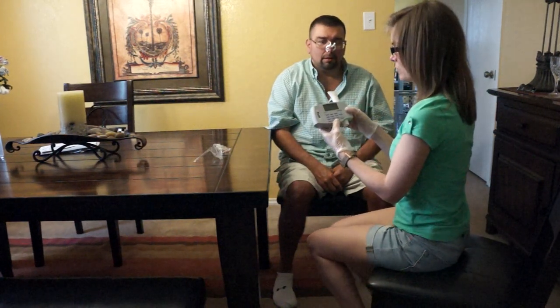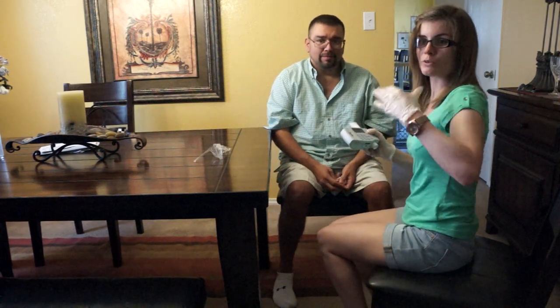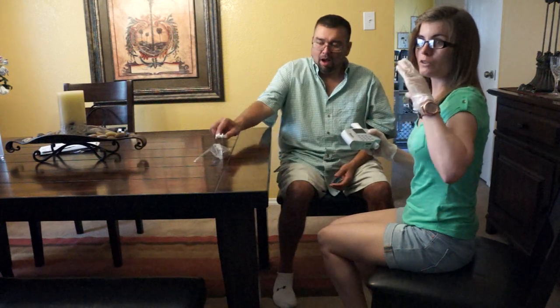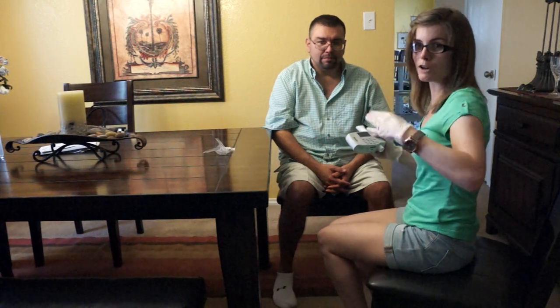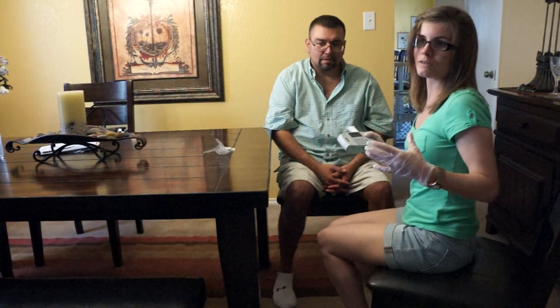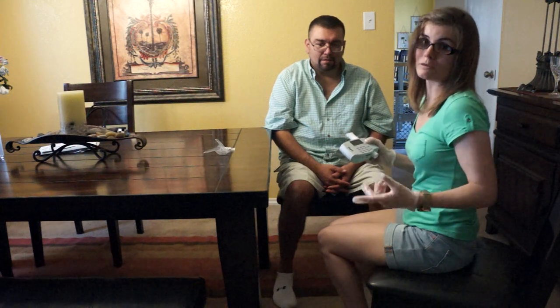All right, it says session complete. Great job. So he did good. Even though he coughed a little bit through it, he was still letting air out, and that's okay as long as they're still getting flow and they're not coming off. A lot of times if they have a sensitive airway and they're coughing because they're sensitive from it, just have them cough through it a little bit, unless there's tongue in the way and stuff like that, then you want to start again and start a new test. But it'll definitely let you know whether or not it was good.